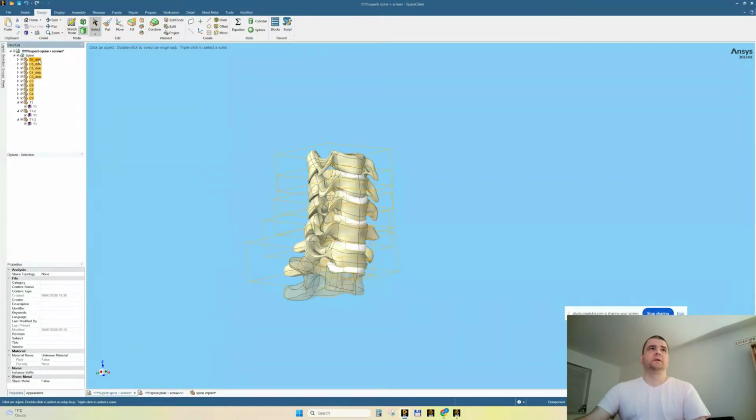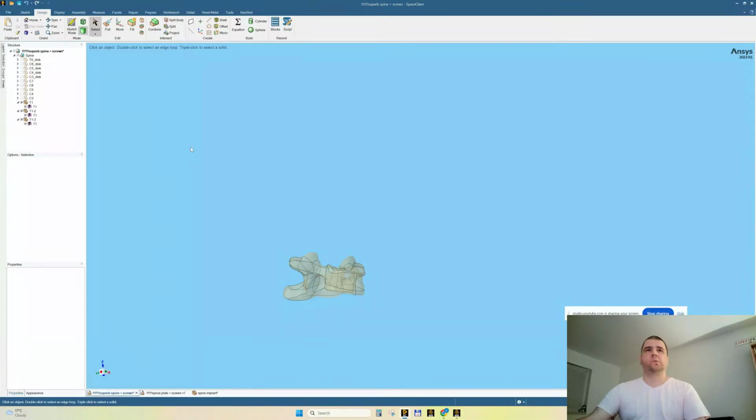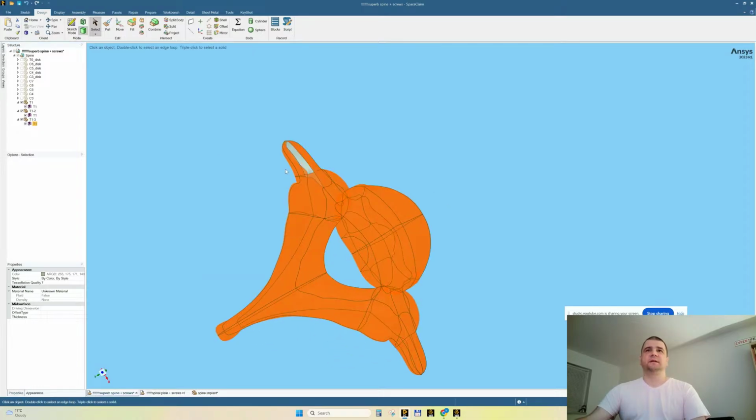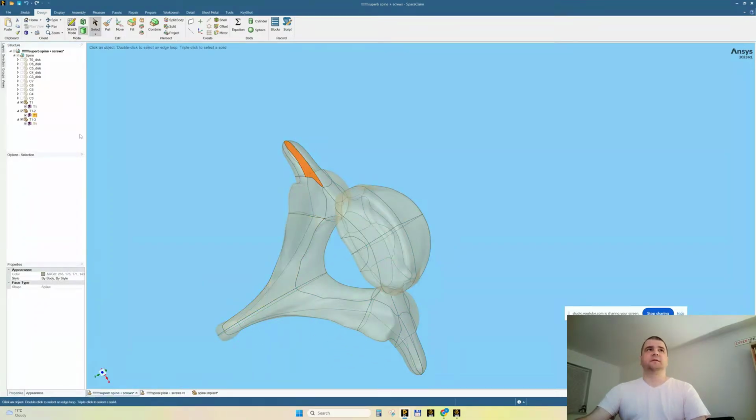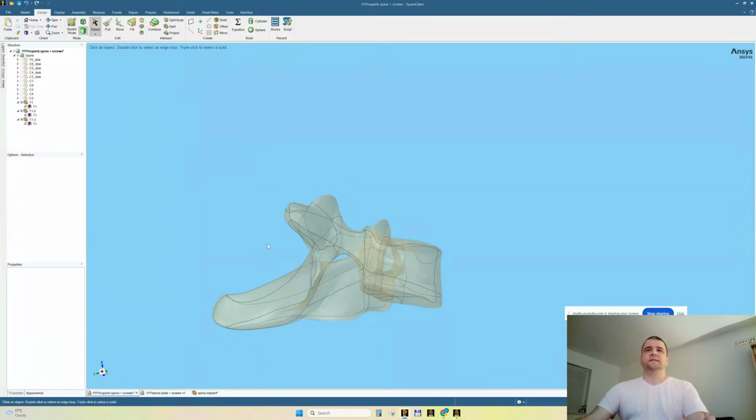Hence, what I will do is hide others, right-click, invert visibility. So I'm keeping these three surfaces. You can see this is split and there is another split surface, this one. These two are kind of split, all right? Let's unite them. This is a surface body. We want to obtain a solid body, meshable and accessory mesh.